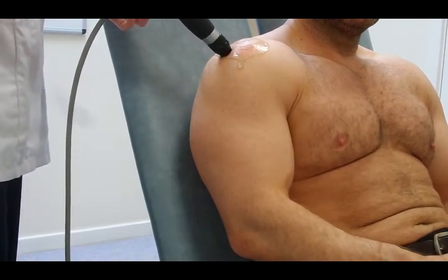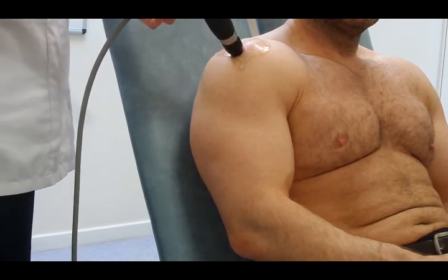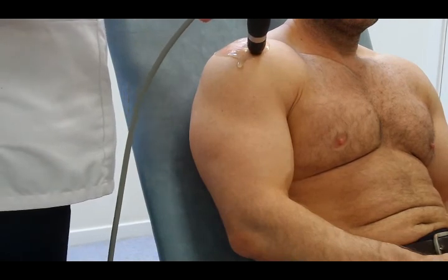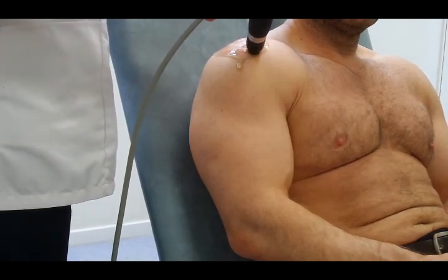It's quite important when doing the shoulder that the patient doesn't do too many impact loading activities either during or immediately after the treatment — I say for four weeks after the treatment.